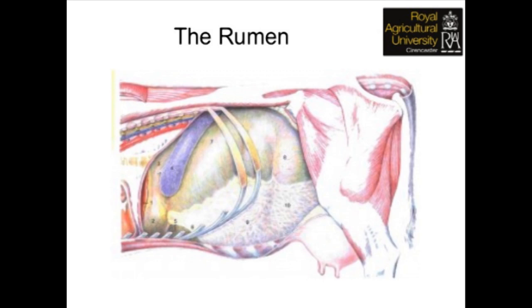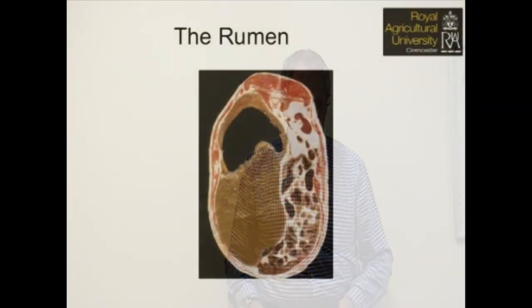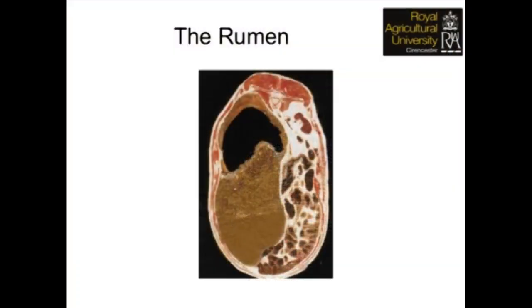And so a rumen bolus will sit in there with other pieces of debris that the cow has ingested, stones, nails, bits of metal, and all the other things that we give to cows that stay in the rumen. Magnets, for example, are designed to go down there. So that's where the bolus sits, down in the rumen reticulum. But in a space that size, with a number of different organisms, and there will be more at the top and different organisms from top to bottom, we can see what the effect of these is here with this cross section through the rumen.